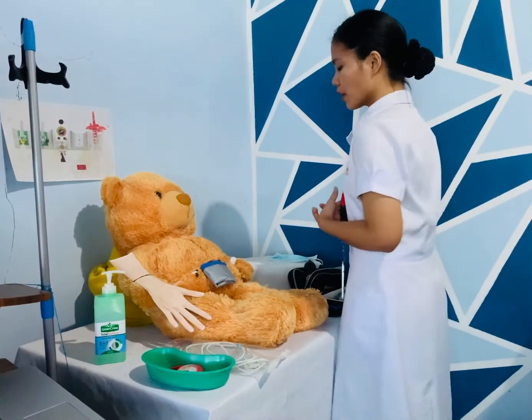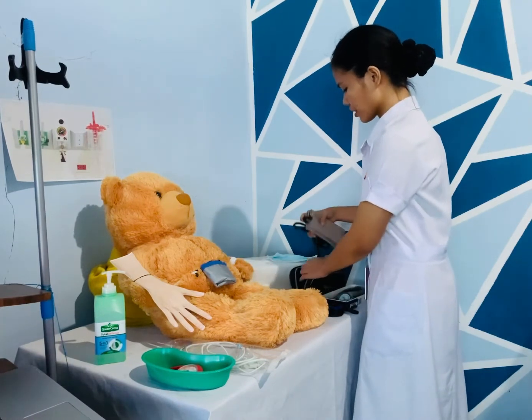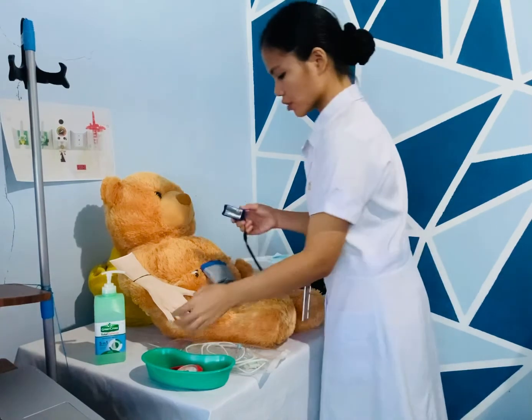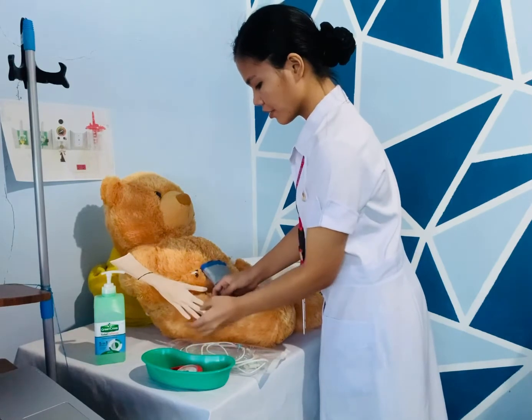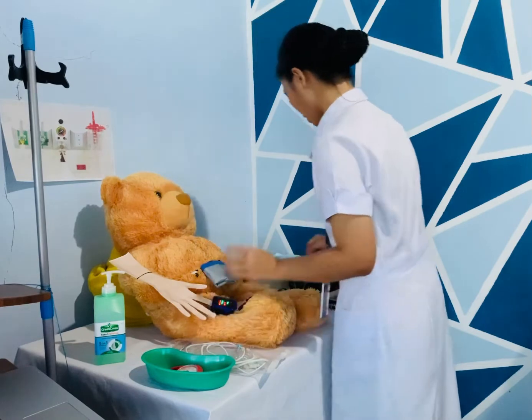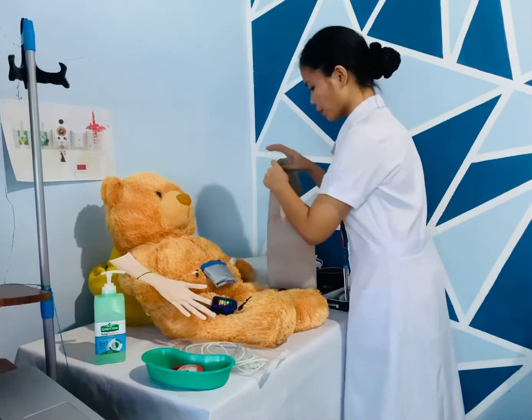Before we proceed, I will first measure your blood pressure and your pulse rate po. Okay, so palagay po itong pulse oximeter sa daliri ninyo to check your pulse rate and your oxygen saturation na din po. I will also check your blood pressure po.